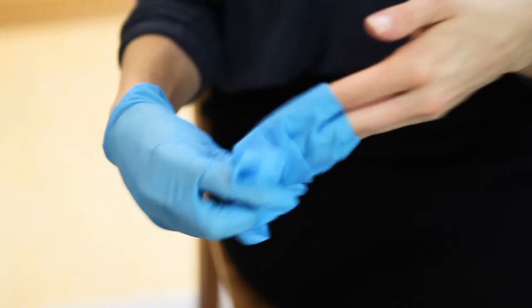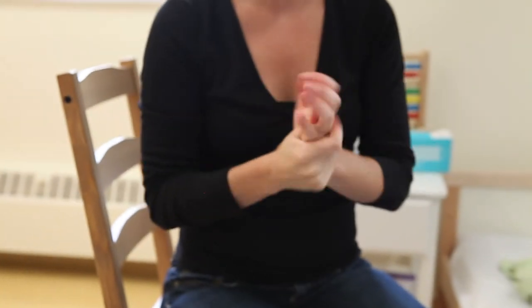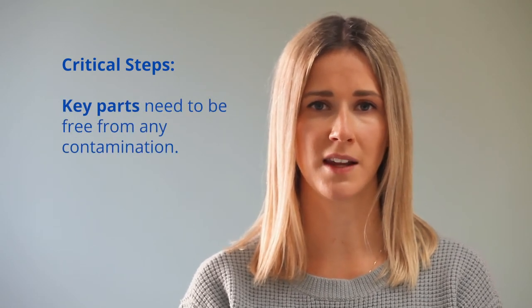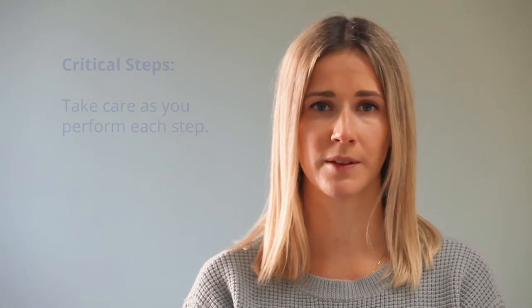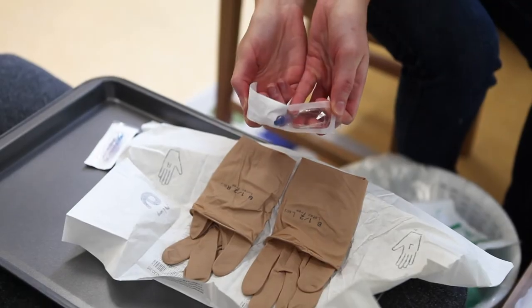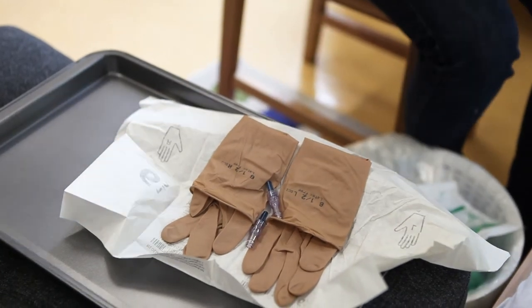Allow the caps to dry for 30 seconds. While the caps are drying, remove your gloves and perform hand hygiene. The next steps of the procedure are considered critical steps because the key parts are exposed, meaning they must be free from any contamination — take care as you perform each step. Take your sterile gloves out of the package and open carefully. Open the new caps onto your sterile gloves package without touching them. There is no need to prime the new cap unless you have been told or taught to do so by your clinical team.